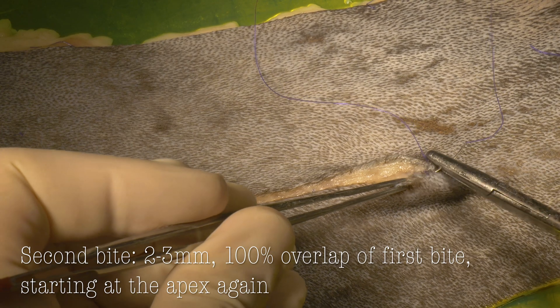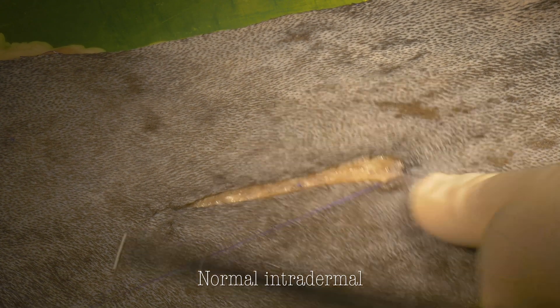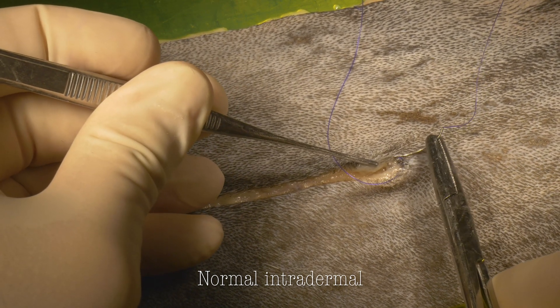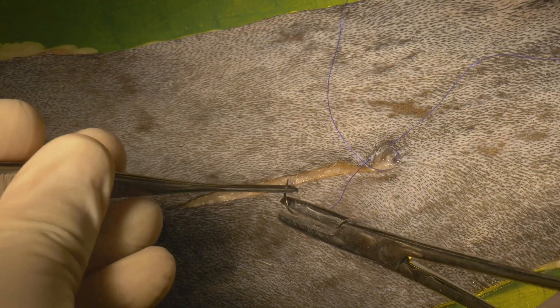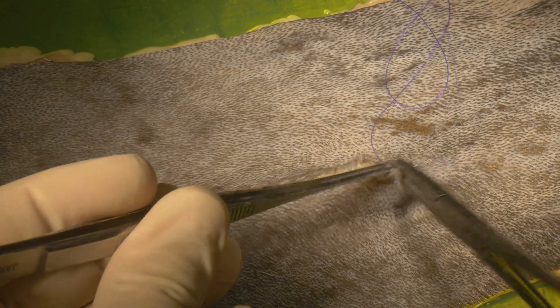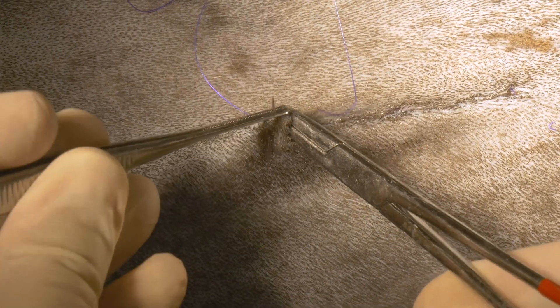You'll notice here I'm gently grabbing the skin, being very careful not to crush the skin. I recommend using rat tooth forceps, like plastic surgeons do, or DeBakey tissue forceps, which we have out in the shelter surgery packs. At this point, we just start our normal intradermal bites, as learned in intro to surgery. For ending the intradermal knot, we're then going to enter into our buried sequence. Our last horizontal bite is on the near side — be sure to pull this loop away so you don't get confused and tie to the wrong loop.